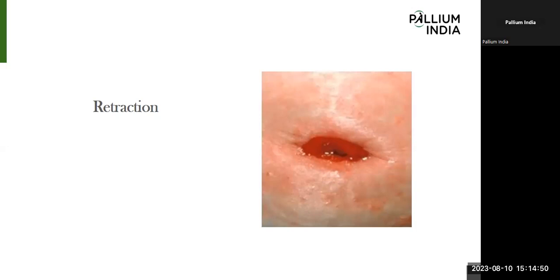Due to the pulling effect, according to the bowel movement, the stoma becomes very introverted or retracted. But here one thing you can see: with a normal stoma, the normal faceplate is what we can use for fixing the colostomy bag surrounding the stoma.